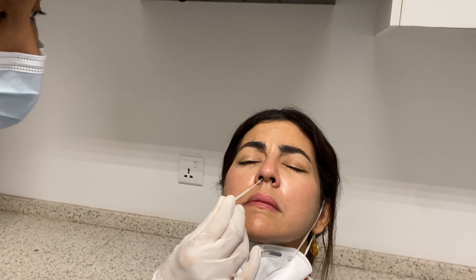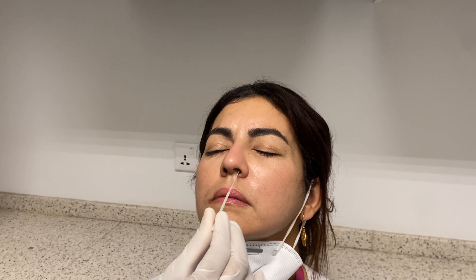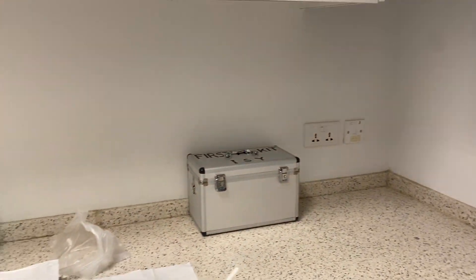Gently and slowly until you feel the resistance. And again, put the swab in and gently rotate five times. You will feel the resistance. It will take more than 10 seconds.